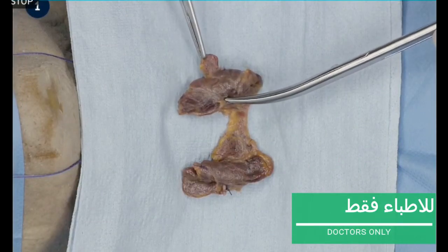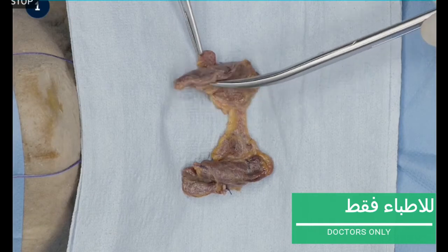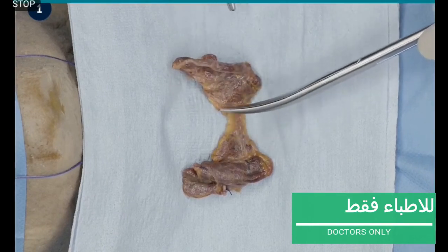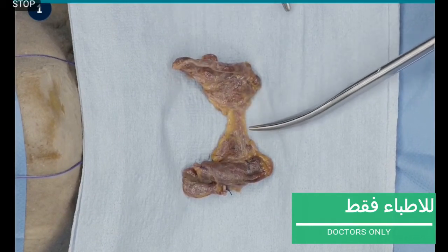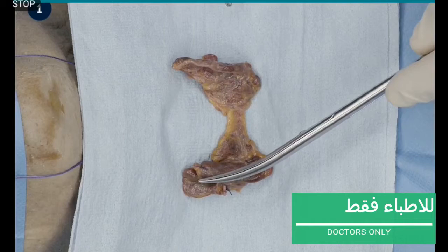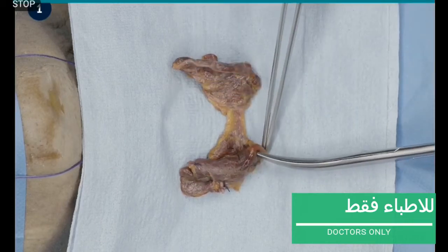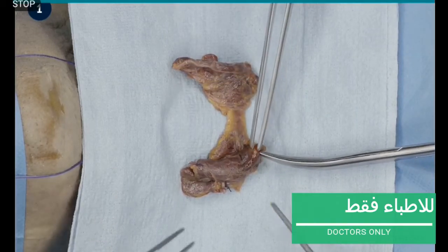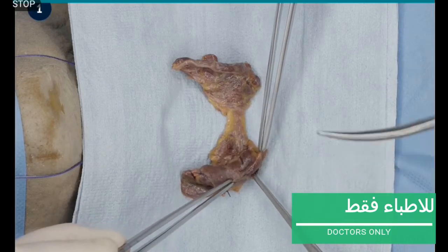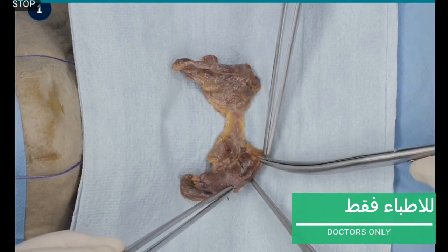This is the tubercle of Zuckerkandl. The isthmus, the upper poles, the lower poles, and on the right lower pole a resected parathyroid gland, which will be re-implanted.